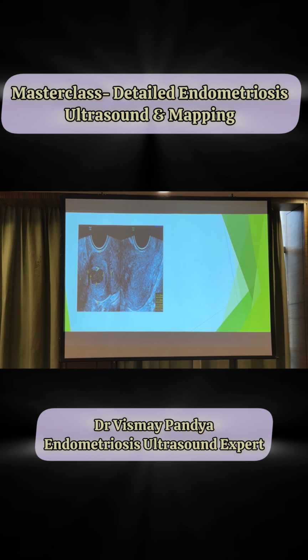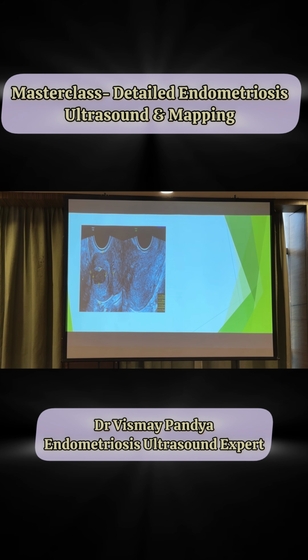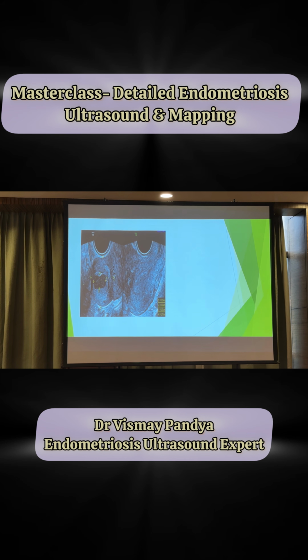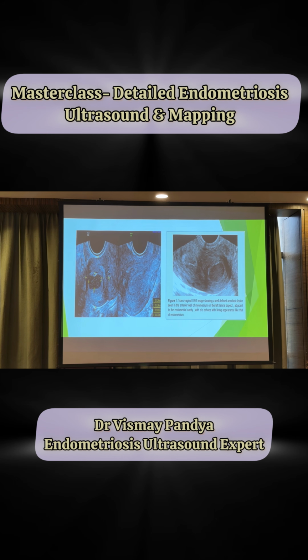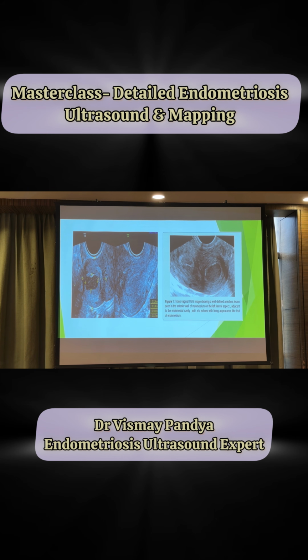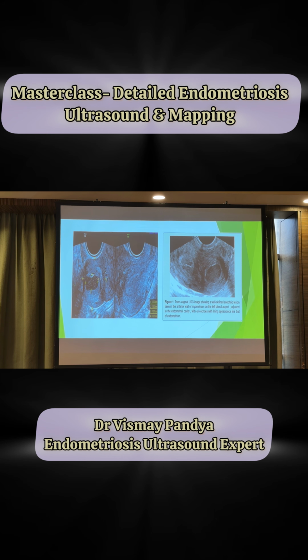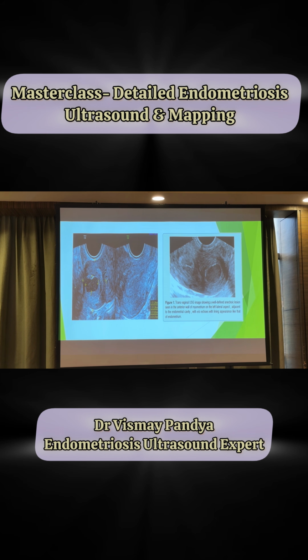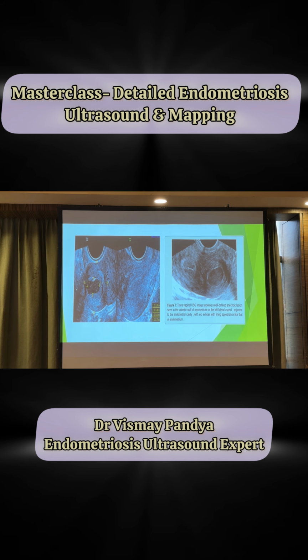So this is how an ACUM looks like. You can see a very well circumscribed endometrial collection. You can see it is very well differentiated from the endometrium. The endometrium is on the left. Such ACUMs can be very well managed with microwave ablation, and for that, USG-guided microwave ablation works beautifully.